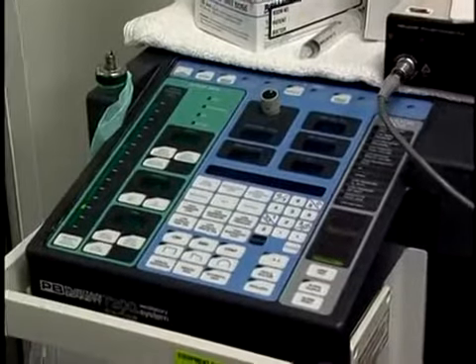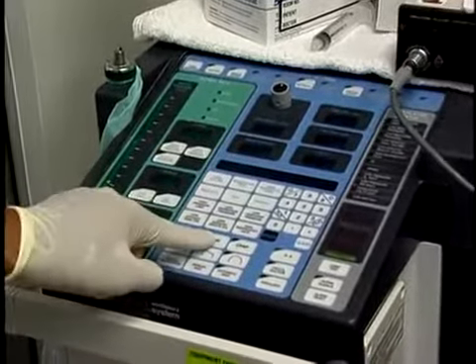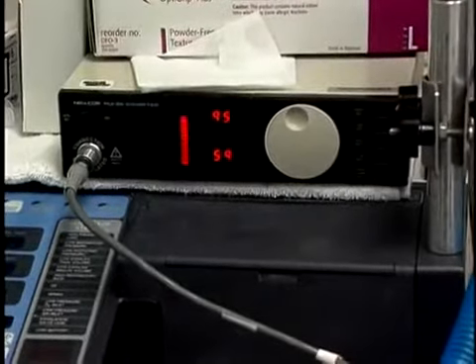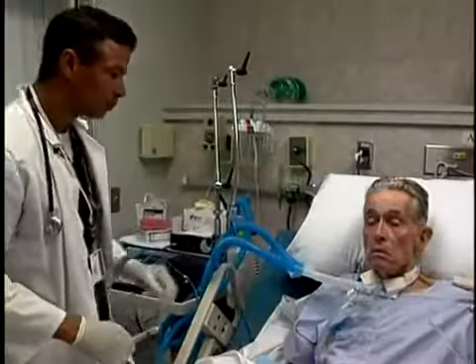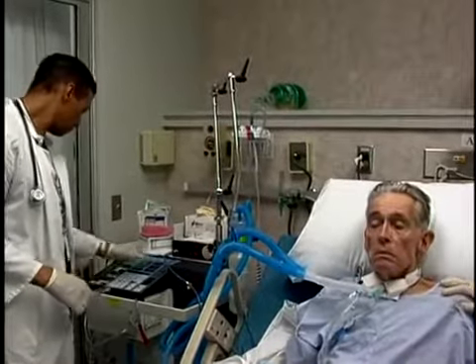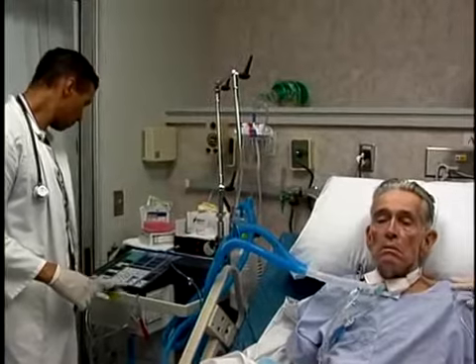Exhaled air will either be directed up towards the upper airway or through the tracheostomy tube back to the ventilator. Therefore, we will no longer be able to accurately measure exhaled tidal volume. For this reason, we must rely on the pressure-volume relationship within the lungs to determine ventilation, much like we do with our neonatal and pediatric patients. If pressure drops, we know that volumes have also dropped. If the pressure remains the same, it is understood that the volume is being maintained.